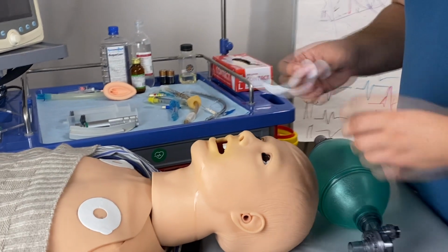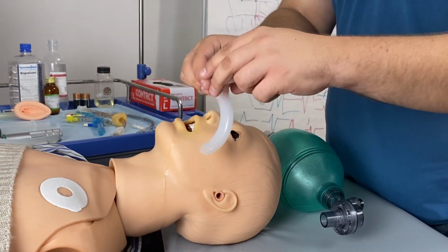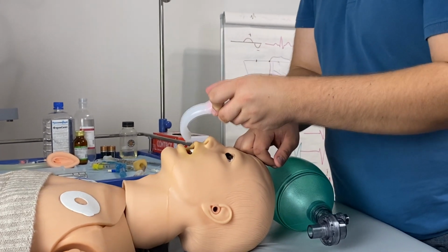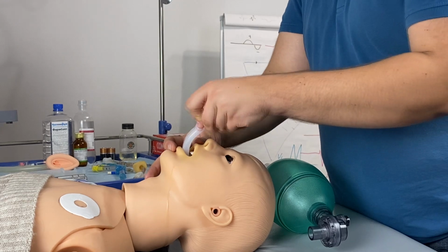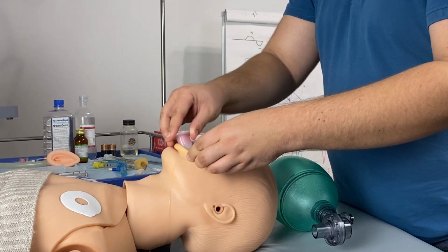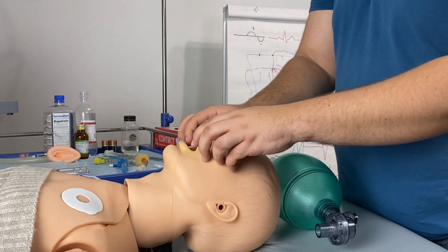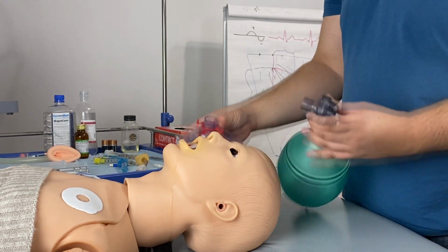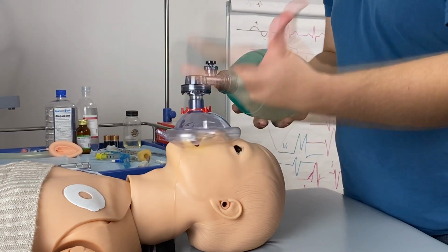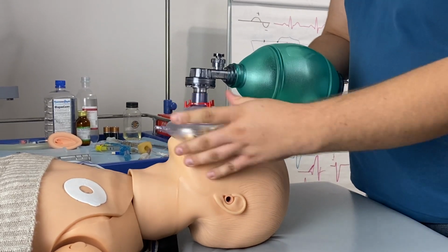Now the oropharyngeal tube. This will be positioned like that, but to insert it inside the patient, we must bypass the tongue, so we will have to rotate it 180 degrees. We open the mouth of the patient, get the tube inside, insert it halfway, then we rotate it back and keep pushing it forward until it's fully inside, on the level of the teeth. And now, as you can see, there is no connector. We'll have to use the face mask again. Letter C, press it down, keep it, and ventilate.